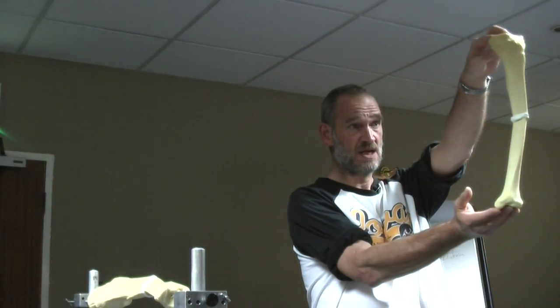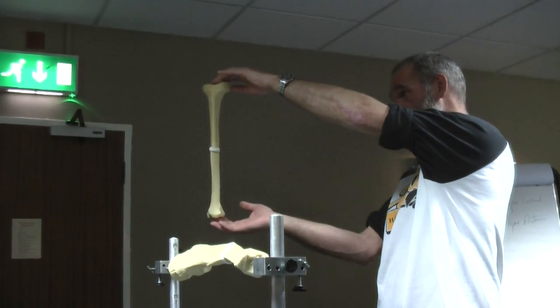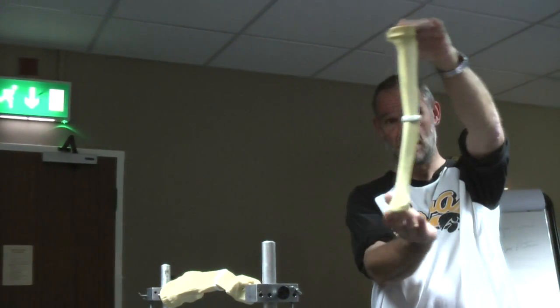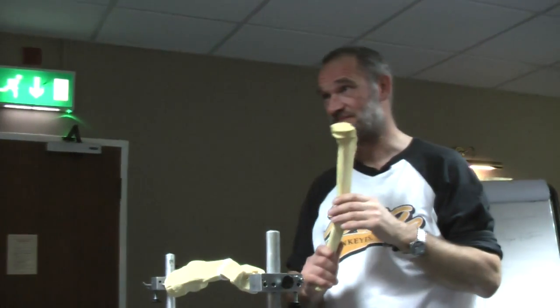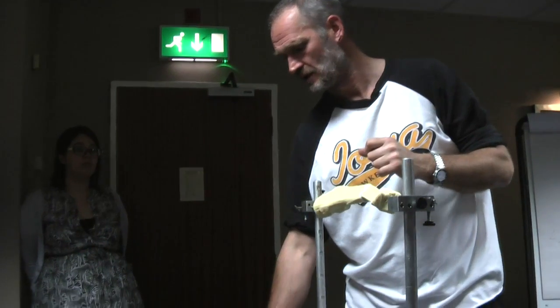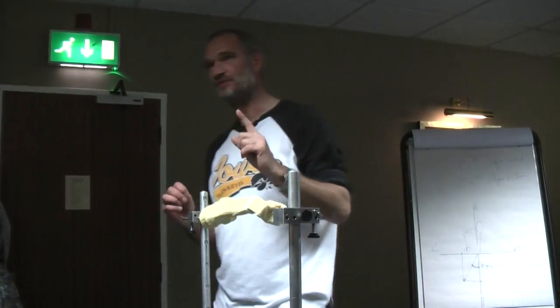And if we take an AP, it's a bit bent. And if you take a lateral, it's a bit bent. Okay? But there is only one bend. It's just not in the radiographer's plane of interest. Okay? Now, because I'm a decent bloke, I've already done your homework for you.